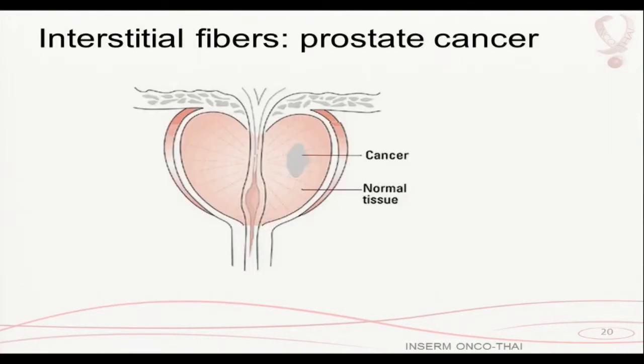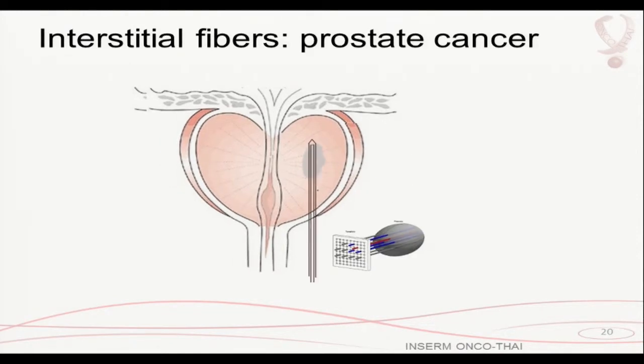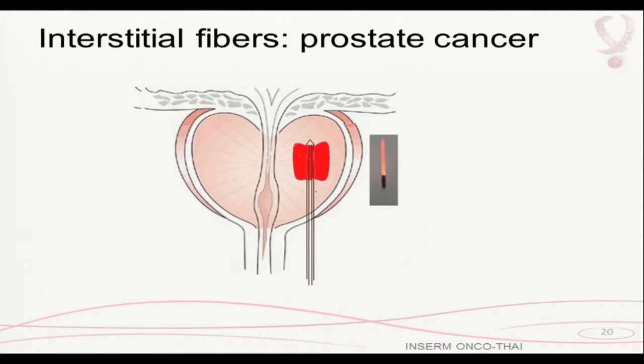Let's move to prostate. When we were contacted 5, 6 years ago by Steba Biotech, they were already running some clinical evaluation, and they came to us and said, we determined the dose with experts, but we have some trouble delivering the dose, and something's wrong. Could you check that? The technique, as you know, is you insert a catheter, you insert the fiber, that's a diffusing fiber, and you should get this kind of illumination.